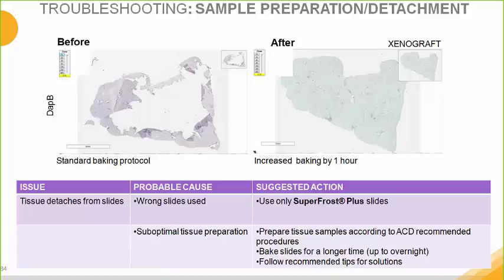This, again, could also be due to suboptimal tissue preparation, which is why it's always important to follow the guidelines. And just as what we did here, you can bake your slides for a longer period of time.